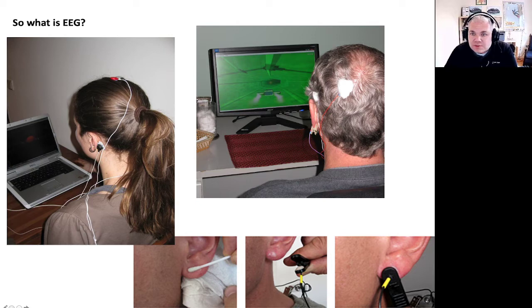Another option is to use the earlobe. So here we have a clip electrode on the earlobe, again because there's very little brain activity coming out in your earlobe, of course, right? So now when we record from another position in the head in reference to this earlobe position, we get brain activity at the recording electrode and no brain activity at the reference electrode. So here's how that sort of works.